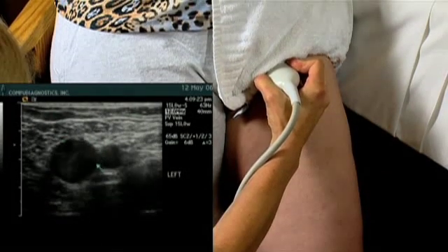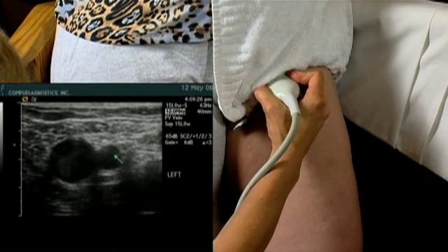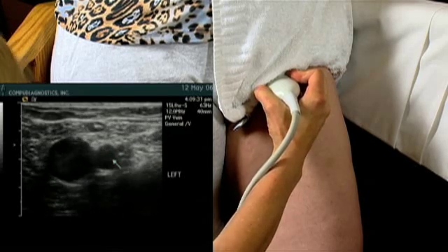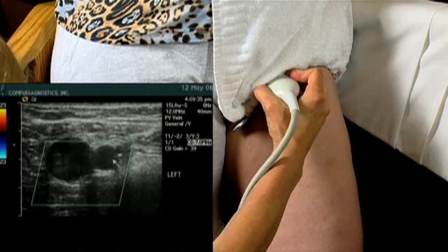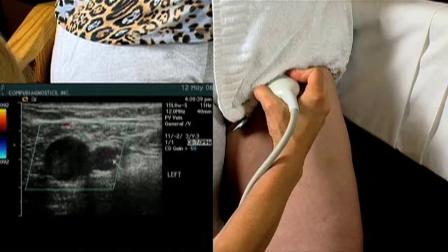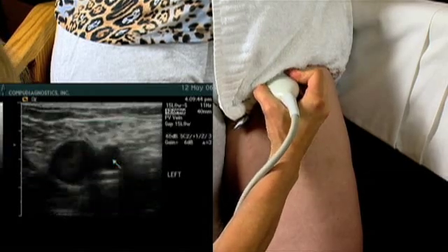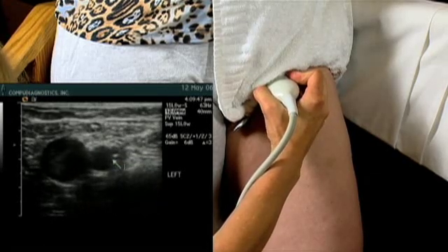We begin in a transverse view, demonstrating the left common femoral vein and left common femoral artery, seeing pulsations in the soft tissue from the artery. We use duplex — a color image in transverse — demonstrating pulsations within the artery and venous flow in the common femoral vein.